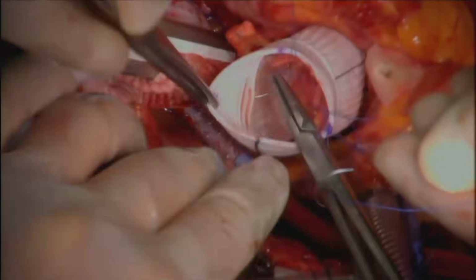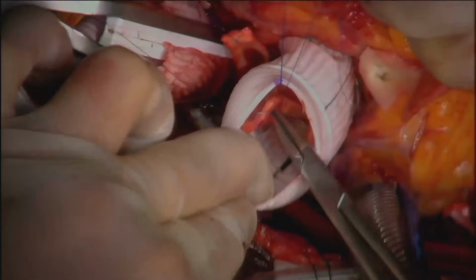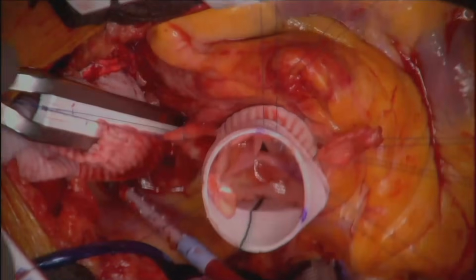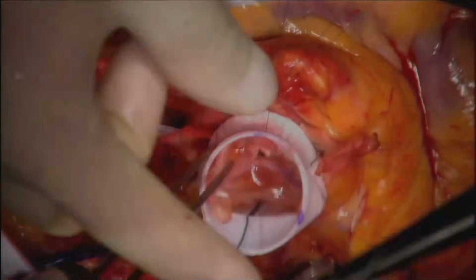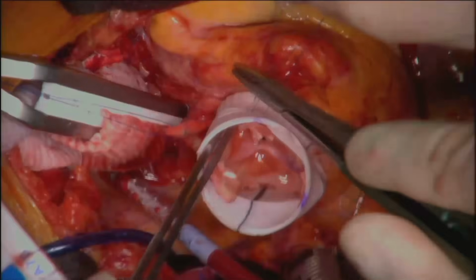The commissural plegeted stitches were passed through the graft and the commissures were resuspended. Each sinus was now sutured to the graft, this being the hemostatic inflow line.